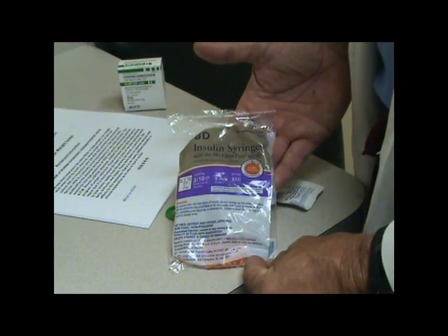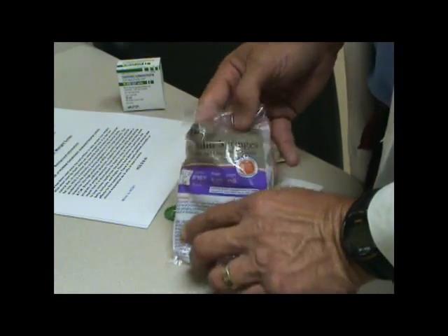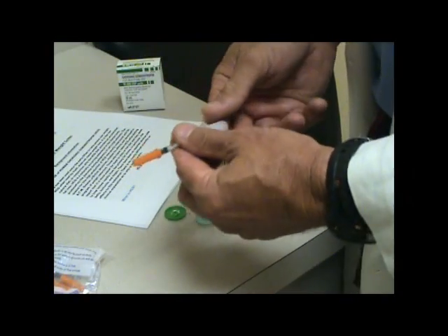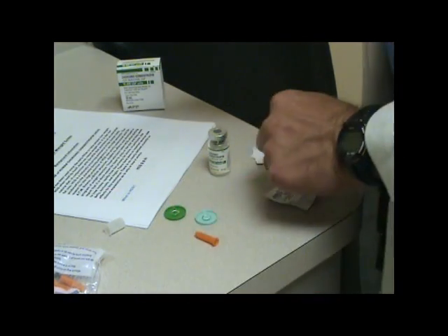These are the insulin syringes I like to use. They're the 3 tenths cc, 8 millimeter, 31 gauge needle. They're very small. Remove the cap, and then remove the second cap.